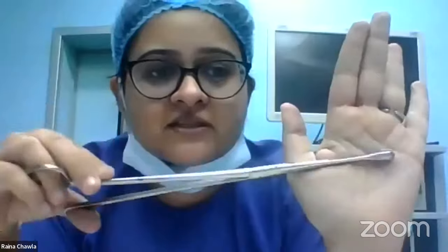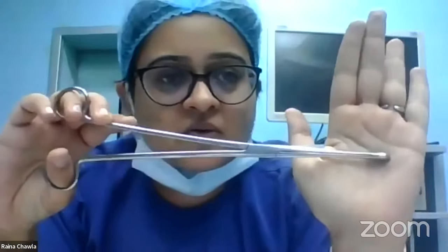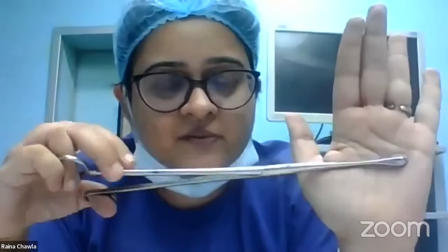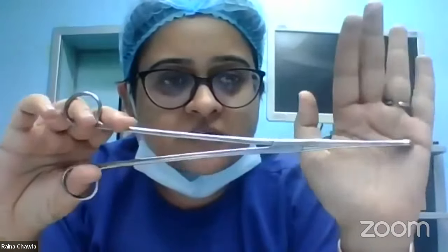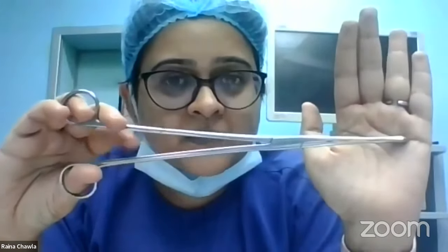Okay, can you see this? I'll show from this end and then like this. Okay, this is an ovum forceps. Why is it called an ovum forceps? Because the end is like an egg. It's an egg-shaped end. That's why it's called an ovum forceps. What other particular noticeable feature do you see in this ovum forceps? No ratchet is present. Yes.